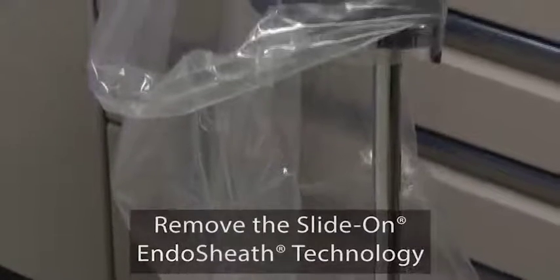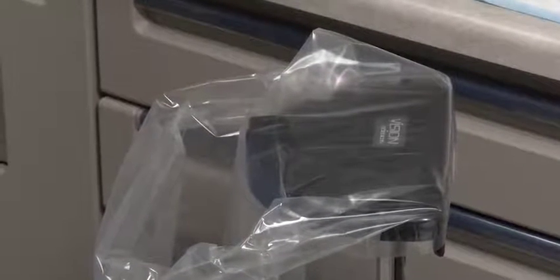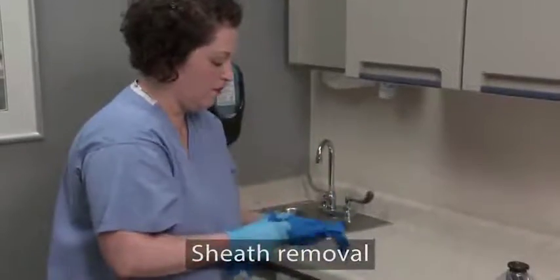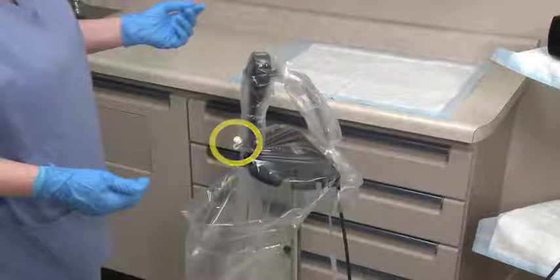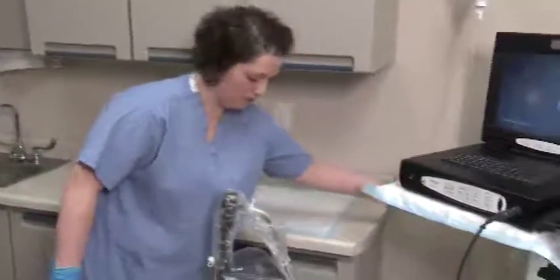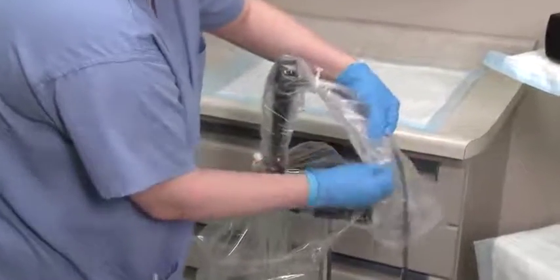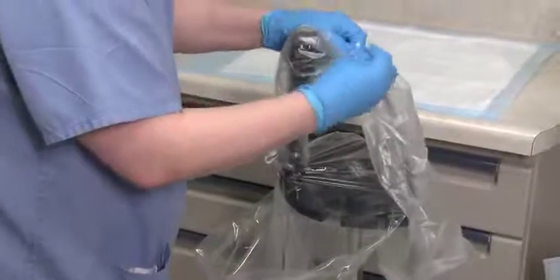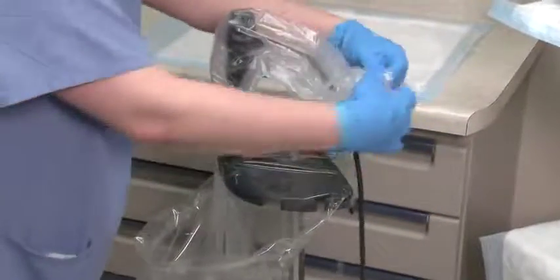Always use the installation stand to remove the endoscope from the sheath. Attempting to remove the endoscope without using the installation stand could cause damage to the endoscope. Put on two pairs of clean gloves. Ensure that the drape bag completely covers the installation stand. Slide the endoscope and sheath into the installation stand with the accessory port facing toward you. The contaminated sheath insertion tube must be contained within the drape bag to capture and contain any patient material and/or fluids. Disconnect the irrigation tubing from the source. Remove the control body cover clips and discard them in the drape bag. Keeping your hands on the outside of the contaminated control body cover, pull the cover forward and down off the endoscope.